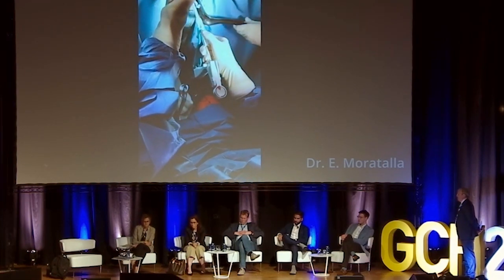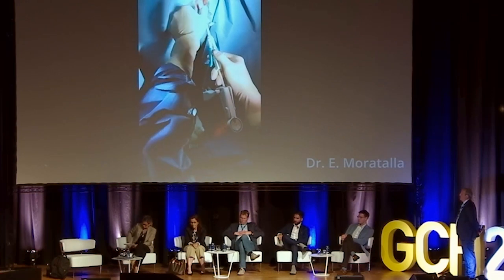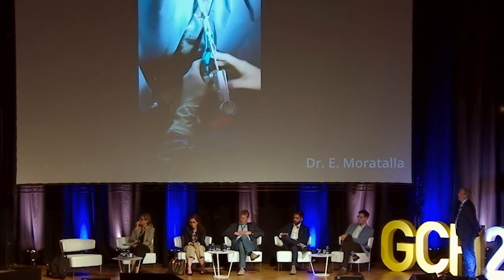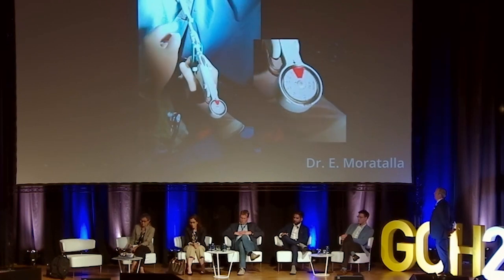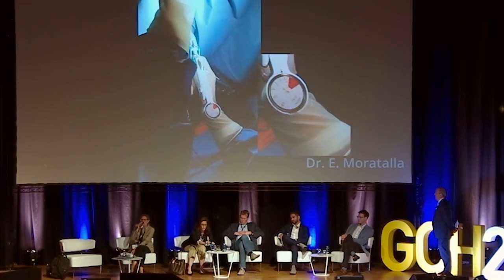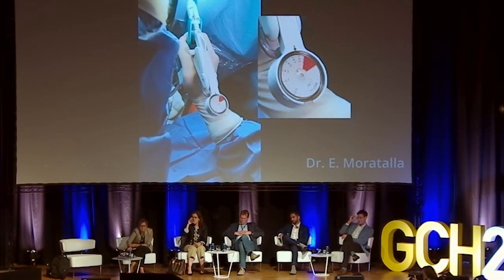Withdraw the disposable device approximately 0.5 centimeters from the fundus. Place the device using the accuracy markings to confirm depth of fundal placement. When inside, we open the device and pull it slightly. Then, we rotate it 45 degrees both ways in order to expand the NovaSure membrane and get the appropriate width measurement. In this case, it is 3.4 centimeters.